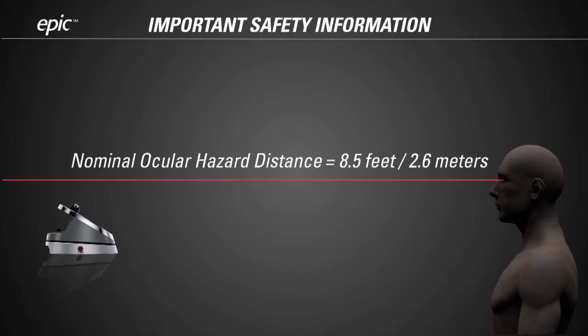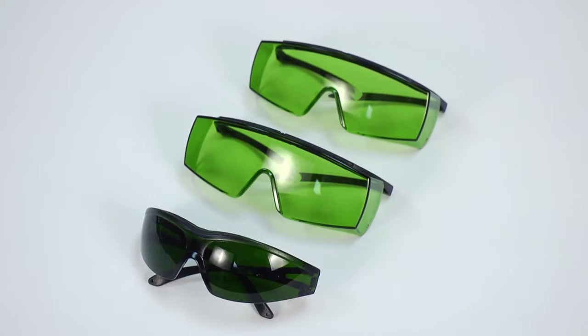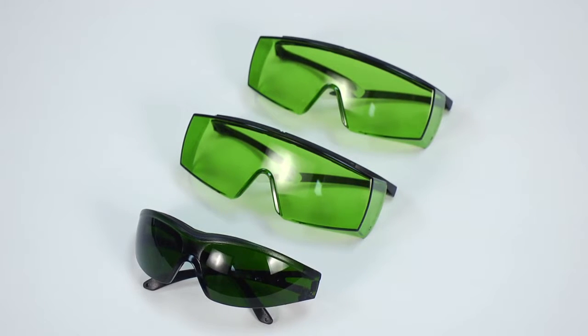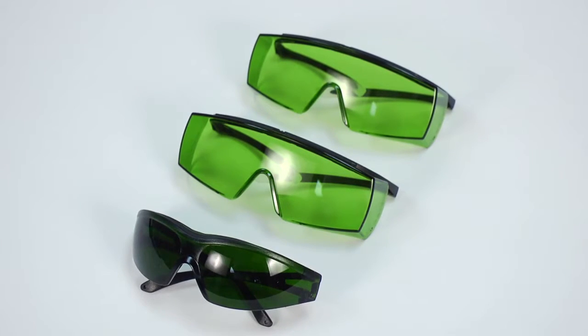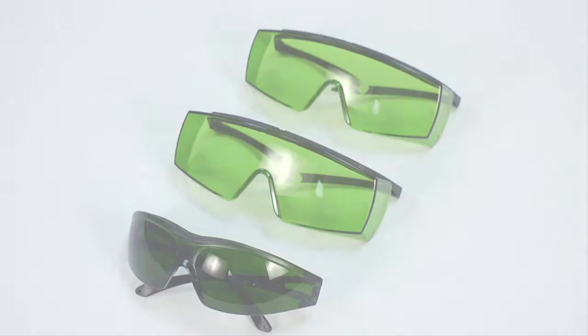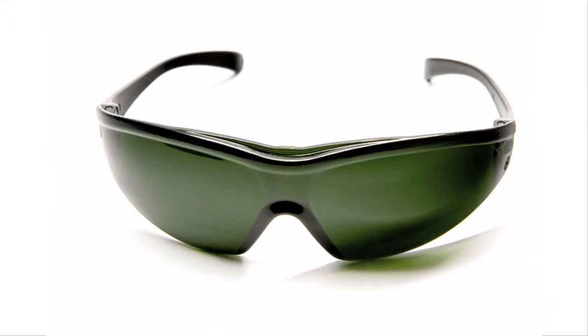This means that everyone in the room where you use the EPIC laser must wear laser safety glasses. The EPIC system ships with laser safety glasses especially designed to protect eyes from the particular wavelength of the EPIC laser. Using other laser safety glasses, even ones designed to block a similar wavelength, may provide no protection at all. Use only the EPIC safety glasses supplied with your laser or purchased through Biolase or an authorized Biolase distributor.